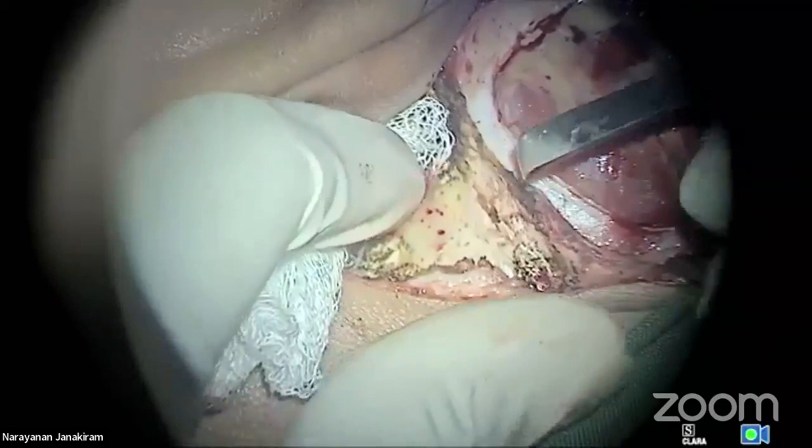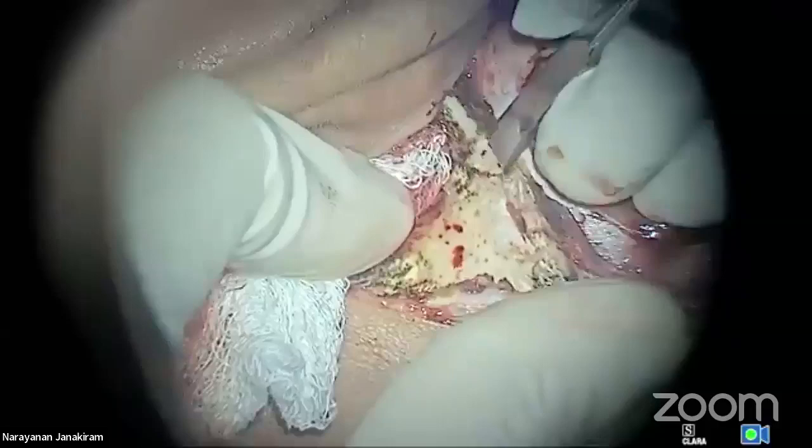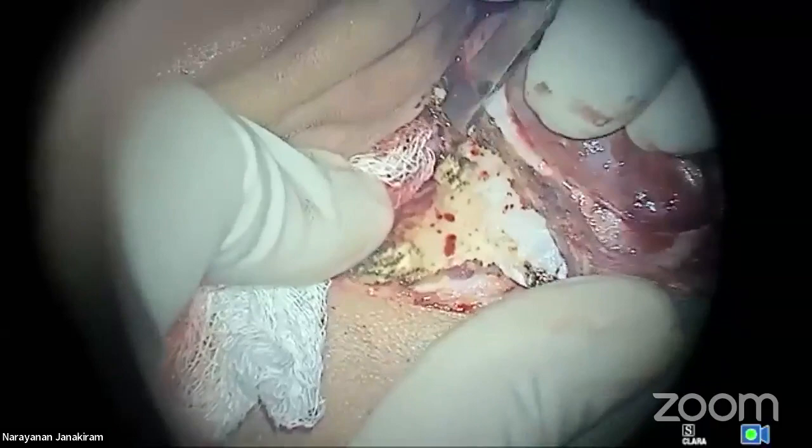Miles. But here, be careful because there's a vein underneath the temporalis muscle which can actually bleed. Okay, that's beautiful. Now if you are on the right plane, it doesn't bleed. Very, very important to be in the right plane. Okay, now knife. Now I'm going to start my incision.